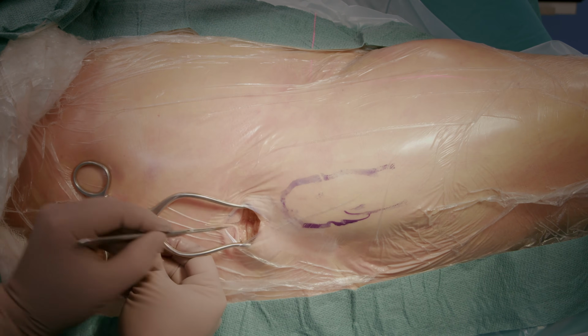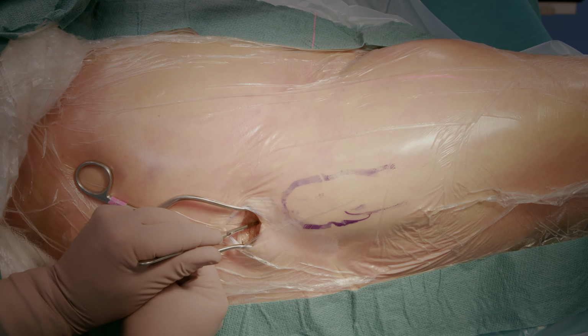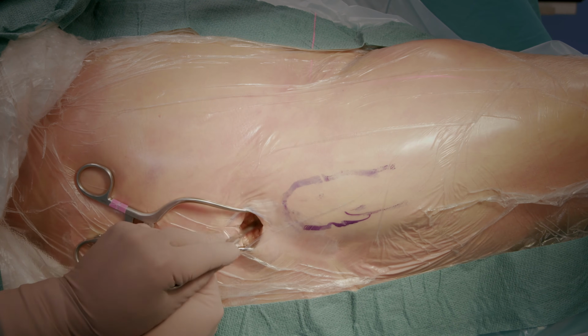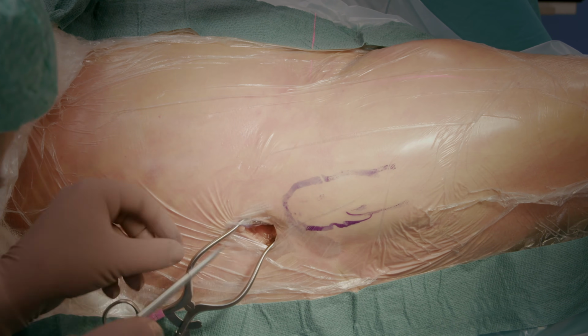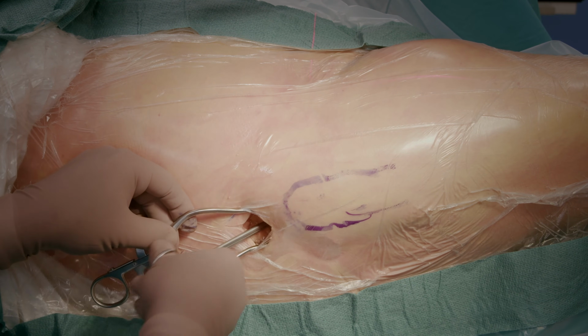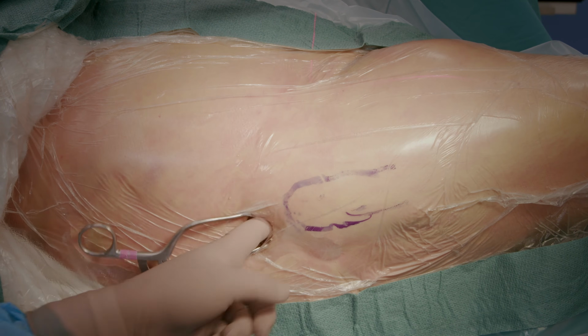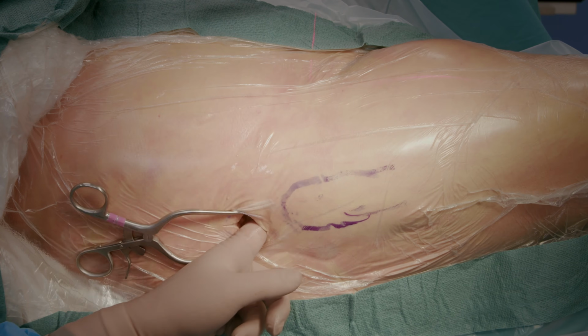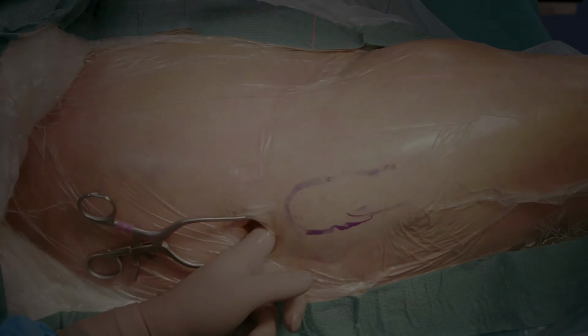Hemostasis should be done here in the subcutaneous area. Make a small incision opening in the fascia. After opening the fascia, check by palpation that you're at the level of the tip of the greater trochanter.